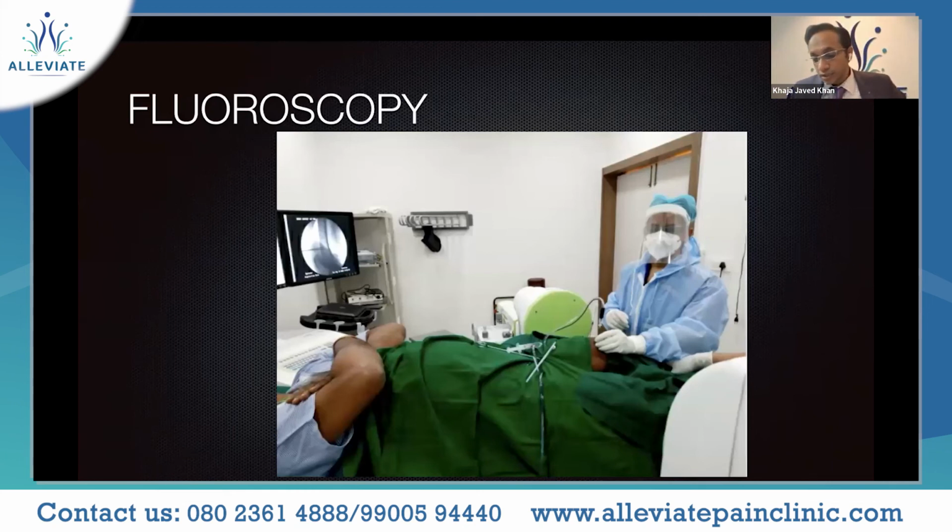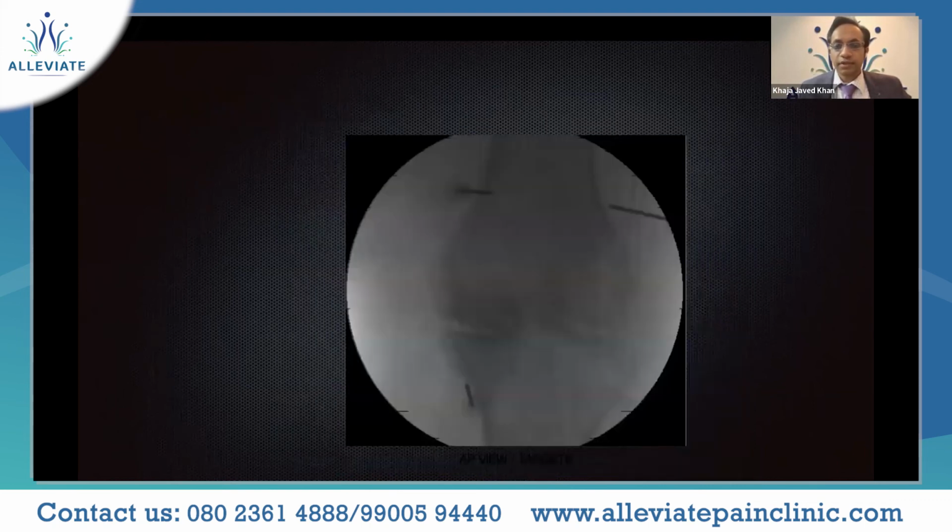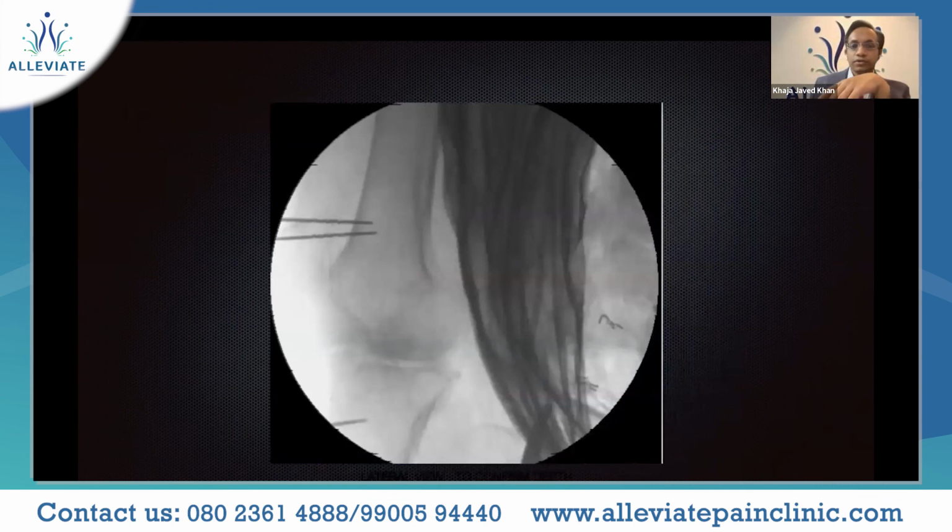I myself learned radio frequency ablation under the fluoroscopic technique only, and which I was using in my patients as well. So in fluoroscopy, we have the targets over here. This is the AP view, what we are seeing. So we are targeting the three nerves, right? The superomedial, superolateral, and the inferomedial genicular nerve targets being at the junction of the shaft and the condyle of the femur and the tibia. So this is the AP view targets, right? And a lateral view is taken so that we can see the depth of the needles.